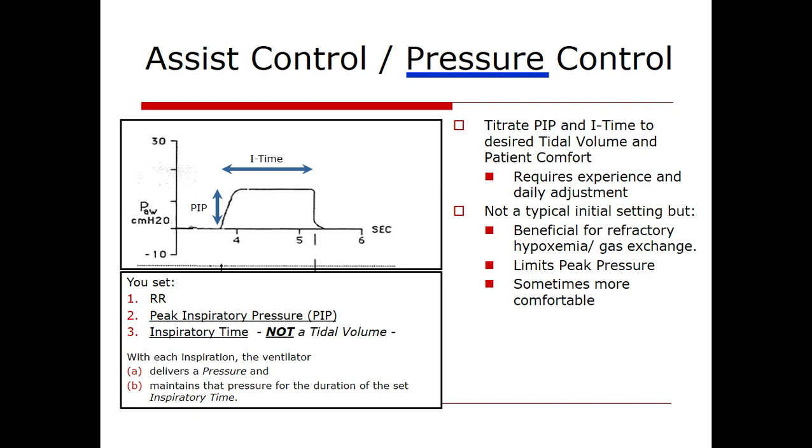Secondly, in some patients, it's just more comfortable in a very variable and unpredictable way. You can't tell which ones will be more comfortable or not, but some are. And thirdly, you can imagine if you push the breath in and you hold it in for a little while, that may give more time for gas exchange. So in ARDS, we will frequently switch to ACPC. So ACPC, when you see it, what you're doing is every so often they get, by the rate you set, a peak inspiratory pressure applied, and that pressure will be held in for the duration of the inspiratory time. Questions about ACPC?